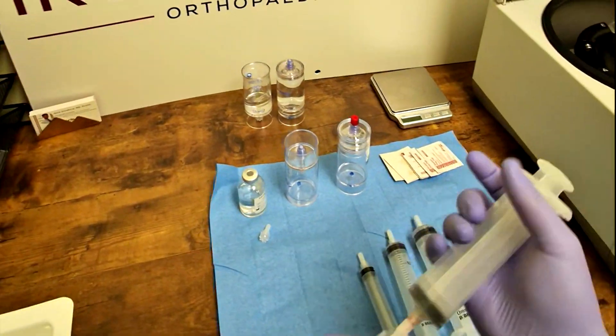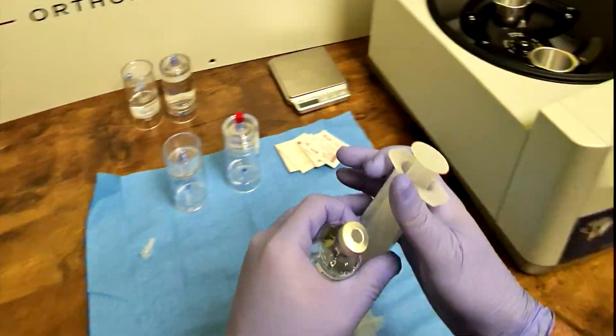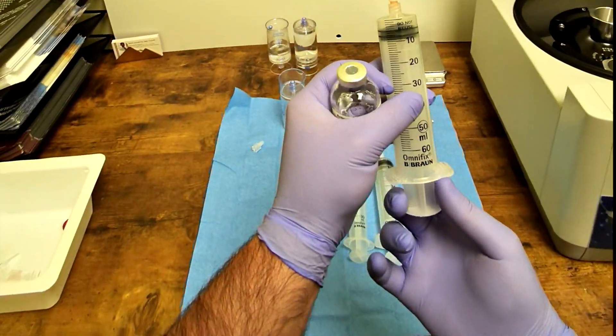The first step is to draw 6 cc's of sodium citrate, an anticoagulant which keeps the blood from clotting during the process.